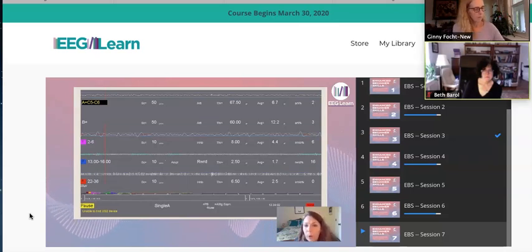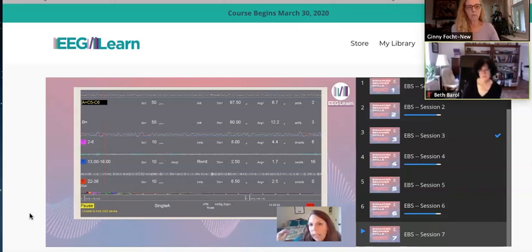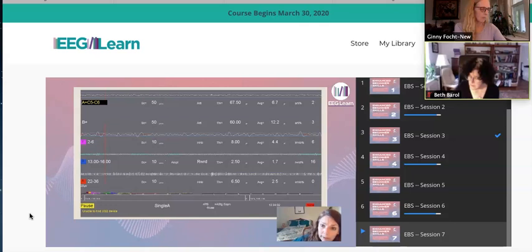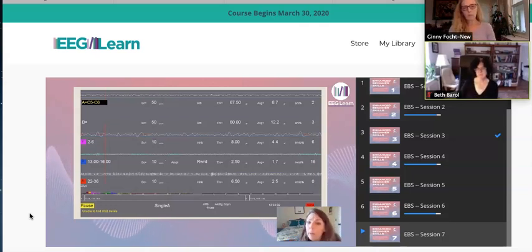With bipolar protocols, you would not want one of your inhibit band activities shooting up independently of the other two. That wouldn't be too good, right? But here, the primary focus of our training is going to be increasing the difference in the reward band. And as long as that's coming up, it's okay if the other two come up as well.